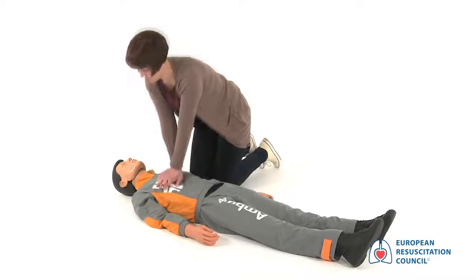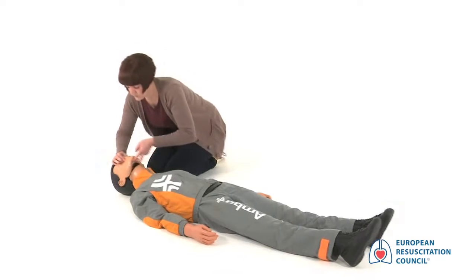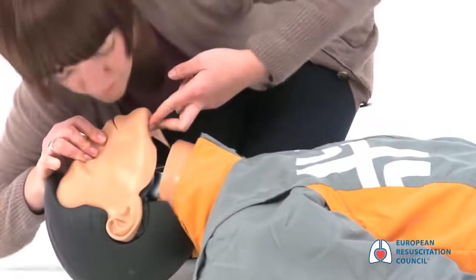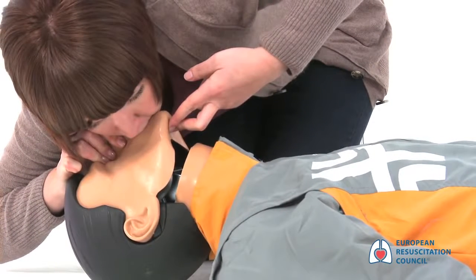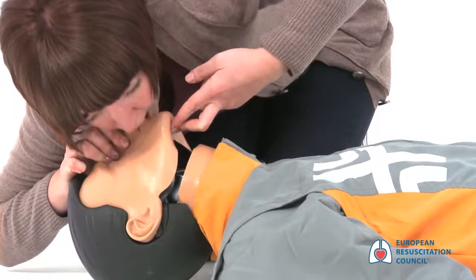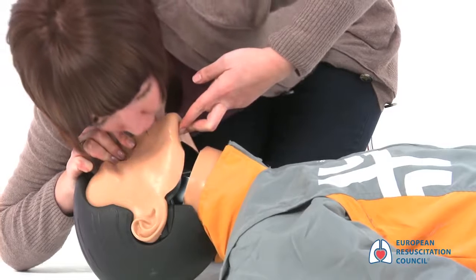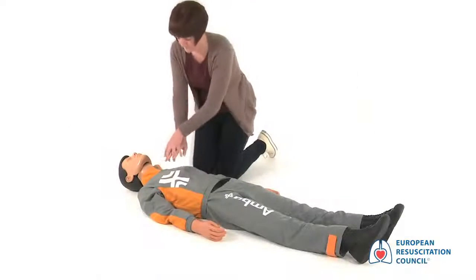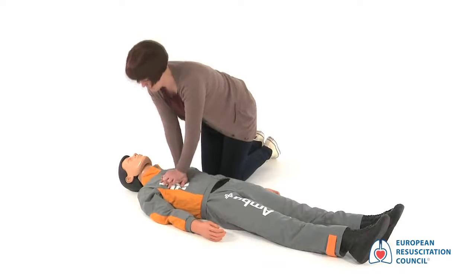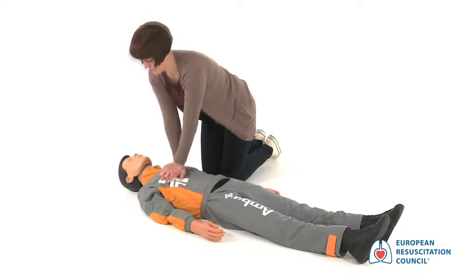After 30 compressions, give 2 rescue breaths. To do this, use the fingers of the hand performing the head tilt to pinch his nose closed. Take a normal breath yourself and place your mouth over the mouth of the victim. Breathe out for about 1 second until the victim's chest rises as if taking a normal breath. Allow the air to come out, then give a second breath. Continue delivering 30 chest compressions and 2 rescue breaths until professional help takes over or the AED arrives.